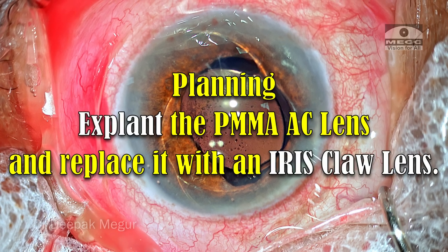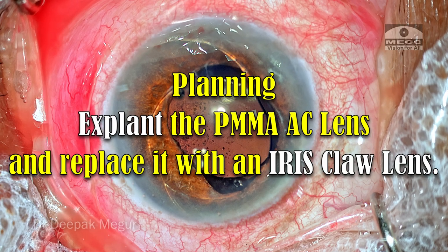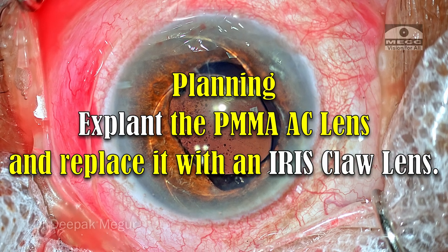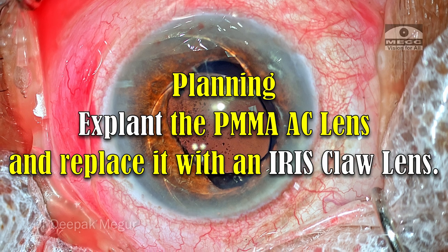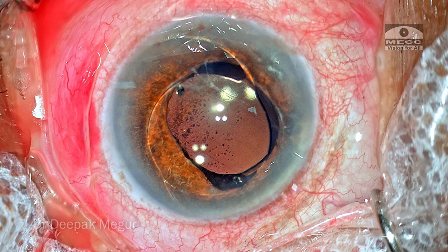The primary objective is to explant this lens and replace it with another lens. In this case, I'm going with an iris-supported lens, that is the iris claw lens. During the process of the surgery, what are the difficulties which I'm anticipating and what precautions do I need to take?